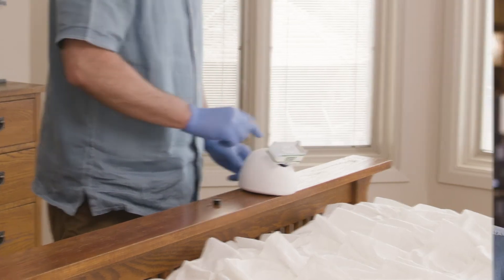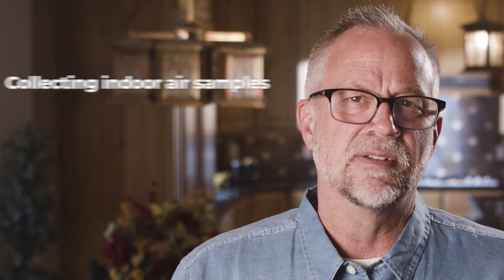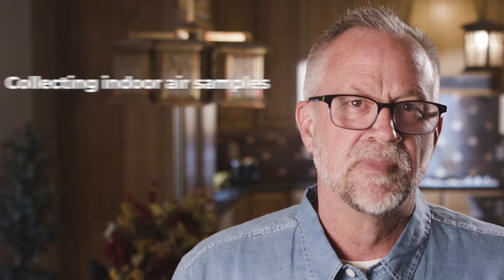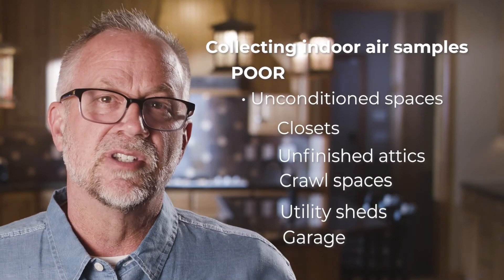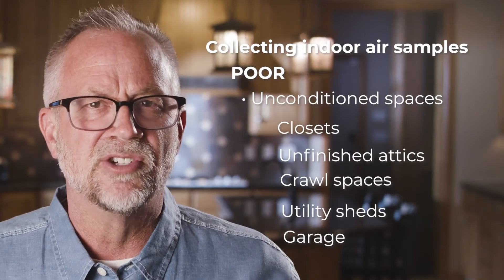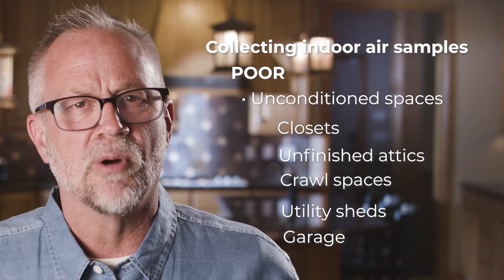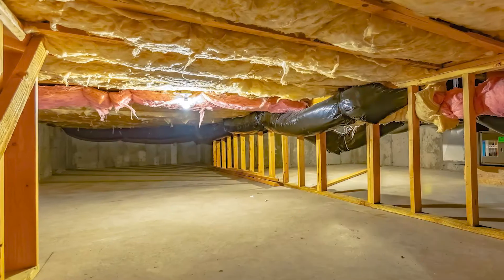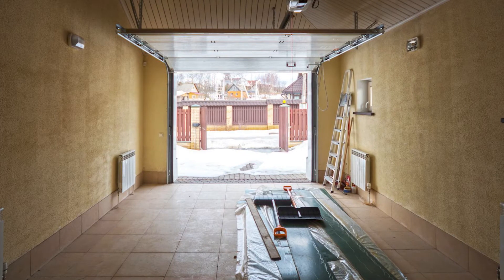Even if an area in the home doesn't quite meet any of these descriptions, you can still collect a sample from any conditioned living space. Indoor air samples should only be collected in conditioned or finished living spaces. Unconditioned spaces aren't appropriate for air sampling since they aren't closed off from the outdoor air and don't have the same level of housekeeping as living spaces. Unconditioned spaces are more likely to have significant levels of background debris and naturally occurring mold spores that have settled, which can lead to false positive results.